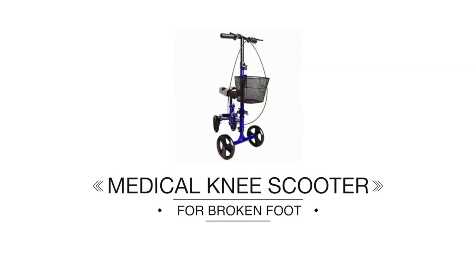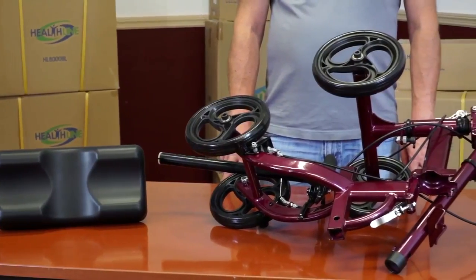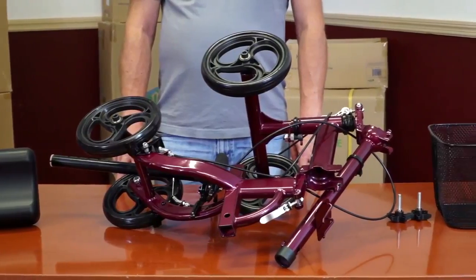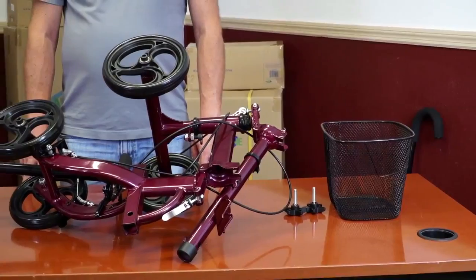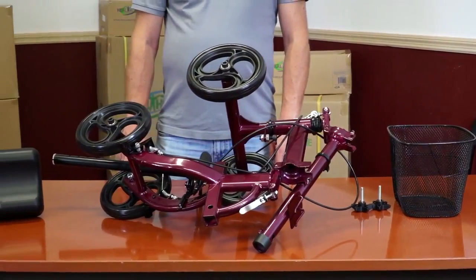Medical Knee Scooter for Broken Foot. The knee scooter arrives in a semi-assembled state. The kit consists of the mainframe assembly, the seat, the handlebar with brakes, two large bolts, and a wire basket.